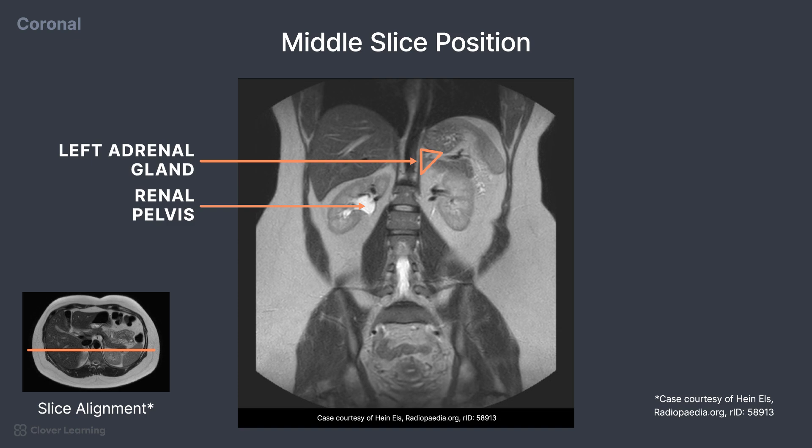Near the kidneys, just to the right and left of the spine, are two grey straight lines which are known as the crura of the diaphragm. We can also see a small portion of the spleen start to emerge.